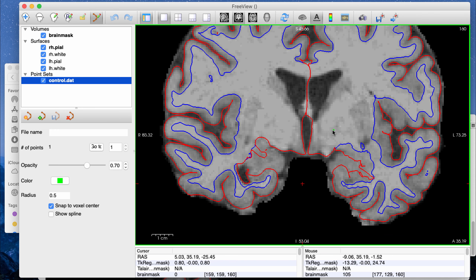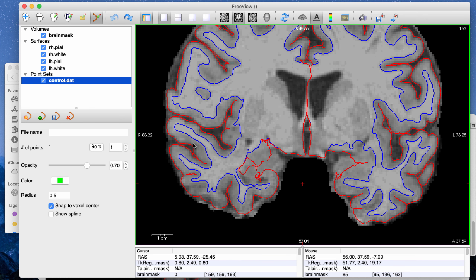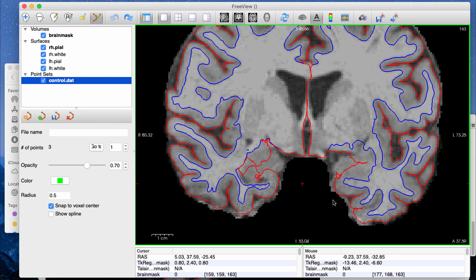Just to do a quick demonstration — once you start clicking around, it will add green dots as long as you're in the correct tool. What the control points mean is that you're adding points where you think there should be white matter that isn't being captured in the blue outline. For control point editing, you want to find places where the blue boundary did not capture white matter that you believe should be classified as white matter, and add points there.